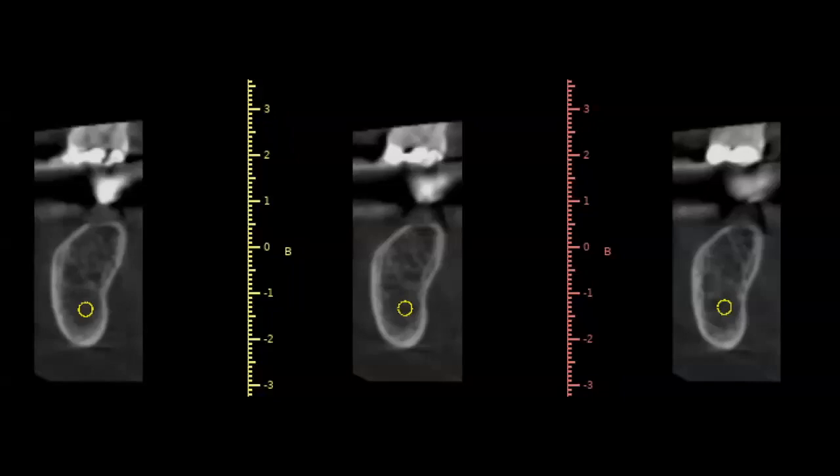But the other benefit is that if, let's say, you have a case and you have this same patient and you want to make multiple guides, a pilot drill guide, a fully guided depth guide, whatever you want to do for this patient, you will only be charged one export per patient. So if you're paying for an export, let's say, I don't know, 12 or 20-something dollars, then you will pay one time for that patient and you can do multiple exports for that same patient. The only time that you will be billed again is if you start a new case with them.